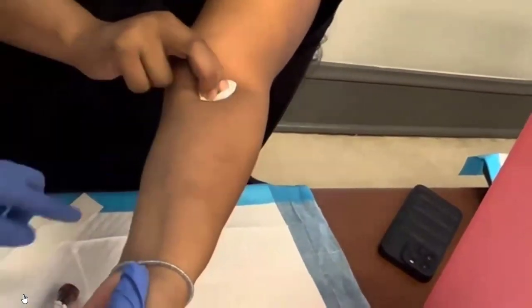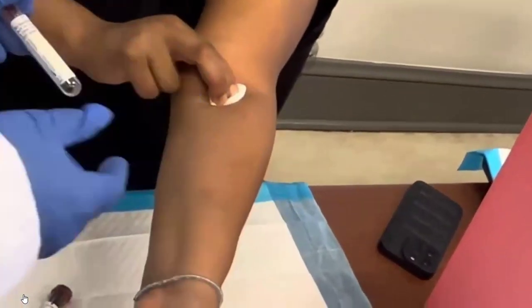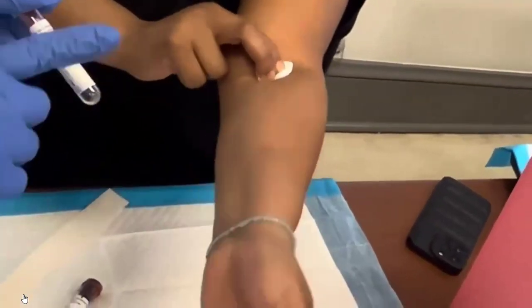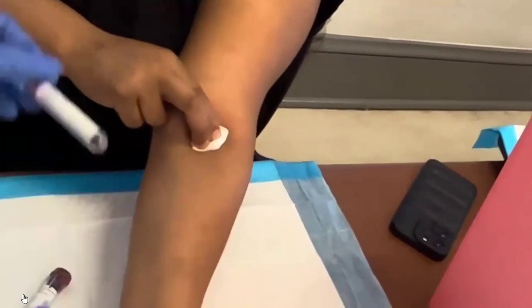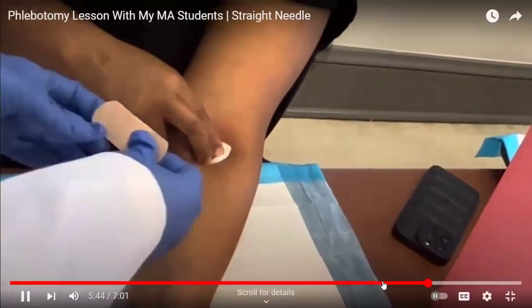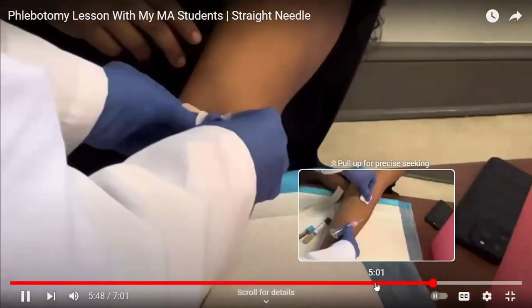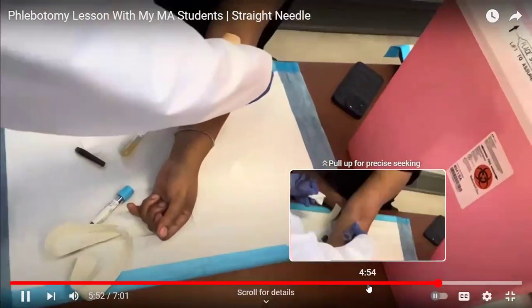So while she's applying pressure, that's when I'm going to go ahead and label my tube with her name, date of birth, my initials, the date, as well as the time, okay? And depending on where you work, you may have a label for your tubes, okay? So once I do that, I'm going to label my tubes, and then I am going to give her a Band-Aid.